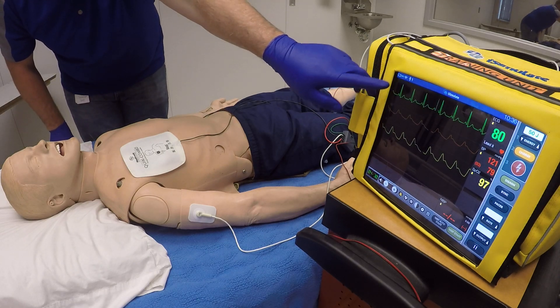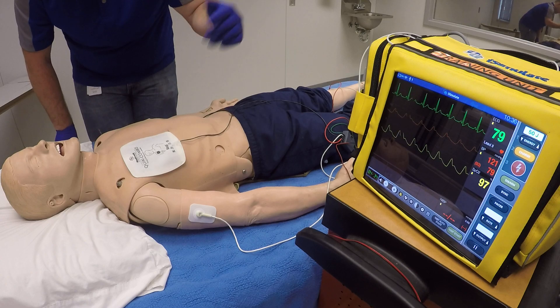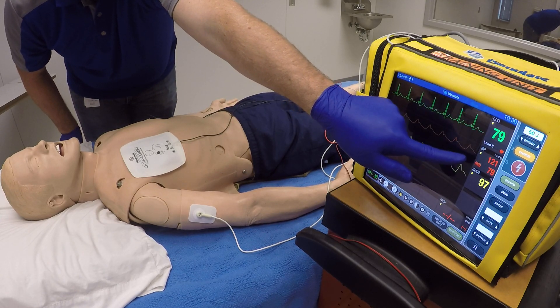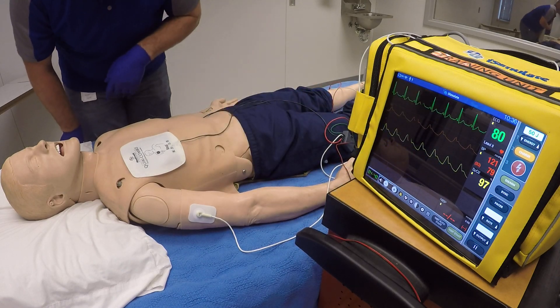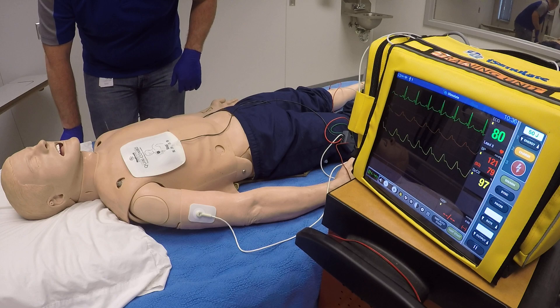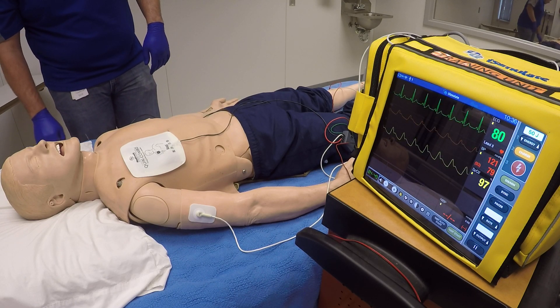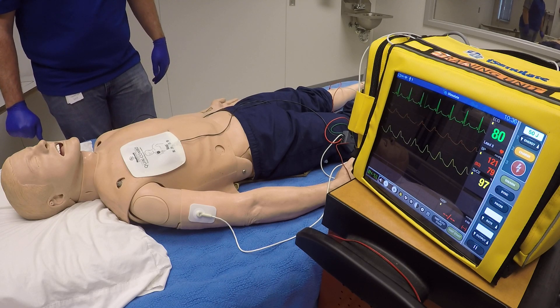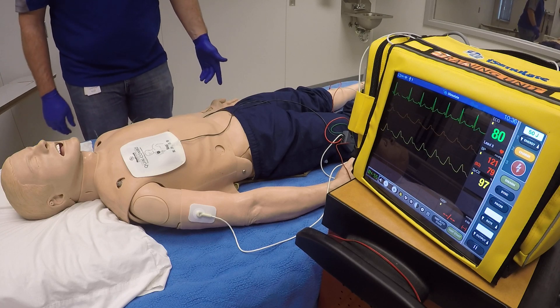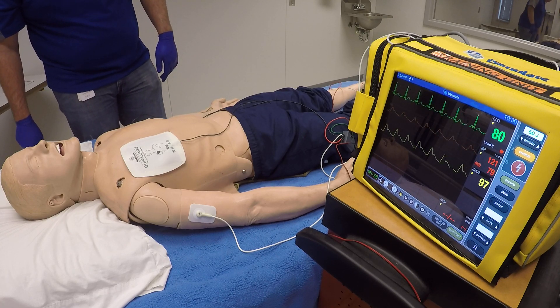Reassess your rhythm — we did have the rate slow to about 80. Go ahead and reassess your vital signs. We've got a new blood pressure of 121 over 79, and our SPO2 reading came up to 97%. You'll want to be talking with the patient to make sure they have desired effects and no adverse side effects. And of course, before you ever shock anybody, if possible, you definitely want to warn them that this is going to happen.